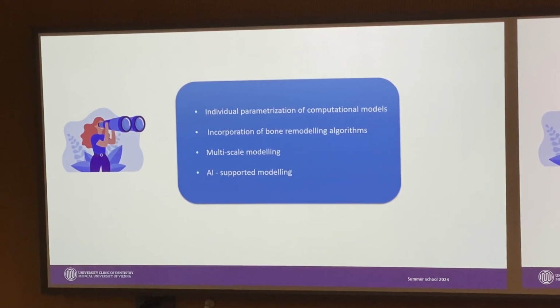There are already some exciting new directions emerging to push the boundaries of the current modeling practices, such as parameterization of computational models to reflect individual clinical scenarios, also the incorporation of bone remodeling algorithms to evaluate the influence of implant loading on bone adaptation over time.